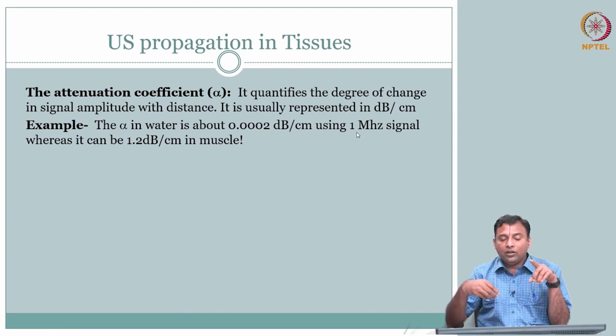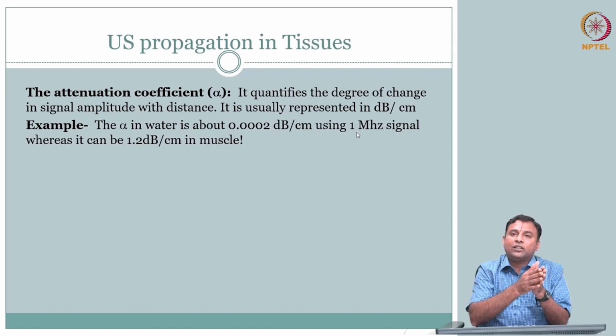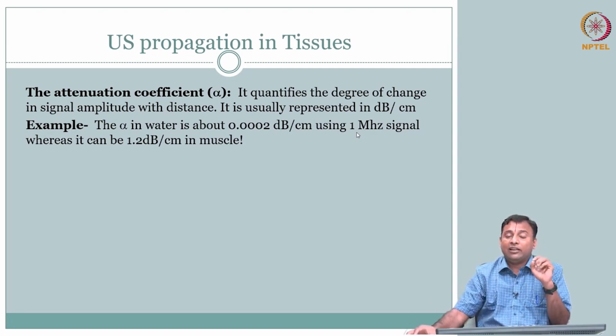So depending on the distance you are traveling and the tissue type, the signal is going to get lost, reduced. Okay. So now you couple this with the small r that we are going to get from a typical soft tissue, fat, muscle, right, very small r. So you see the signal level that you are going to pick is going to be very small.